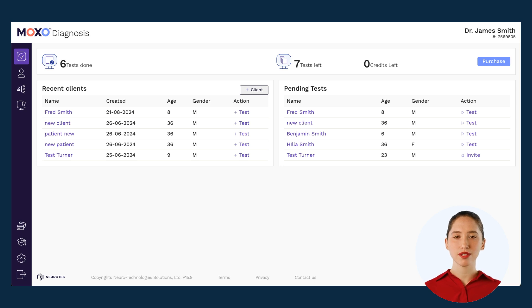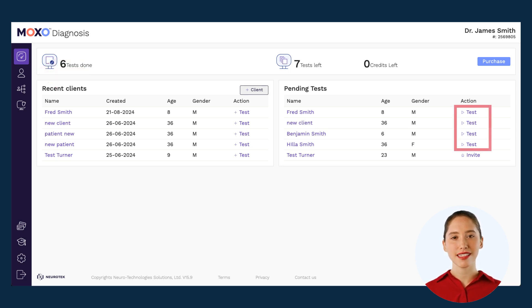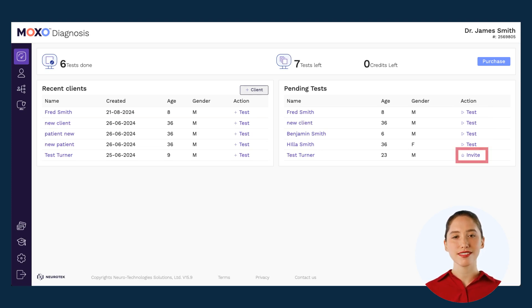When it comes to running a test, this can also be done from both your dashboard and your client's page. If the button says test, it means it's an in-clinic test. If the button says invite, it means this is a remote test.